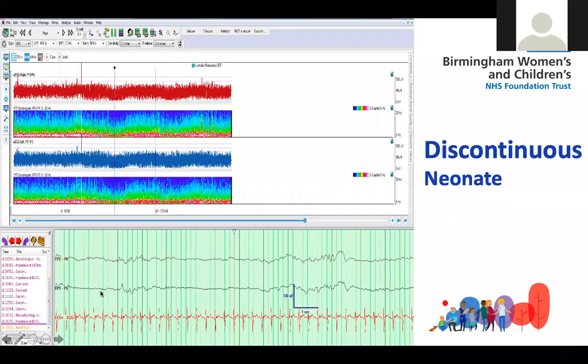And another one that can get quite confusing, that's often confused for a bit of a burst suppression picture, is to remember that lots of our neonates have a more discontinuous EEG. So you get this thicker wide band on the neonates and a more suppressed overall background, which will increase in continuity as the child gets older, around 40, 42 weeks.